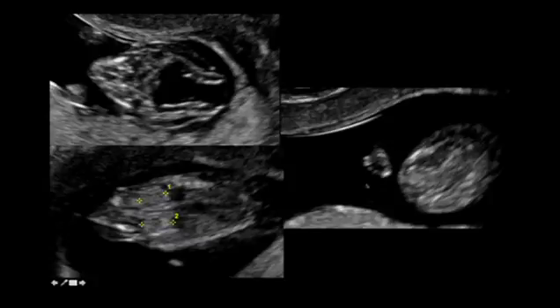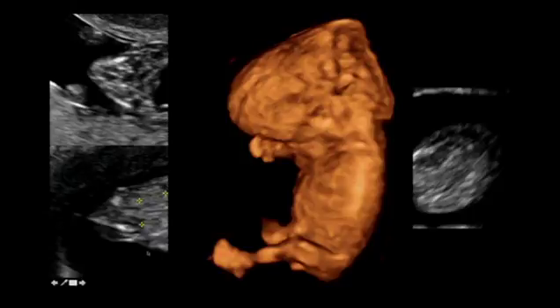So you go specifically looking at the hand, and here's the extra fingers. And then you look at the kidneys, and you find that they are in fact echogenic. In 3D, you can see basically a bird's eye view of this with the encephalocele and the extra digits both in the hand and in the feet.